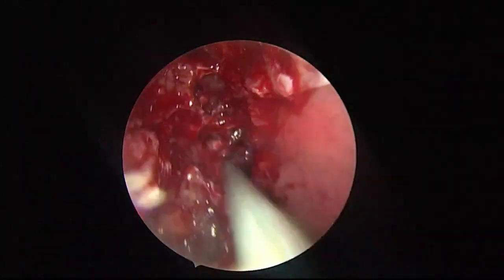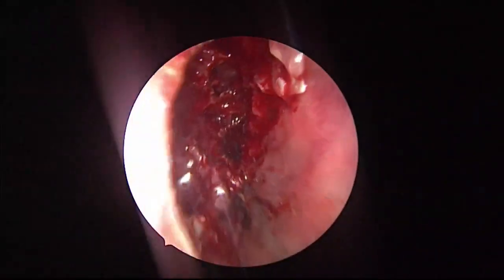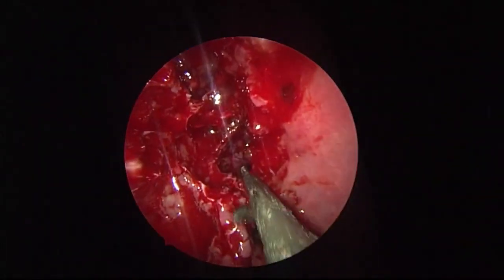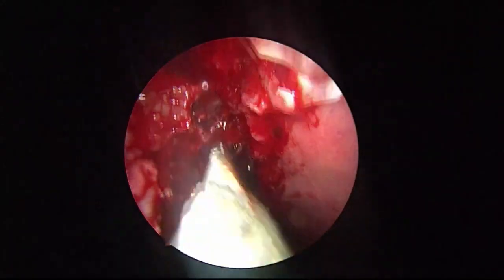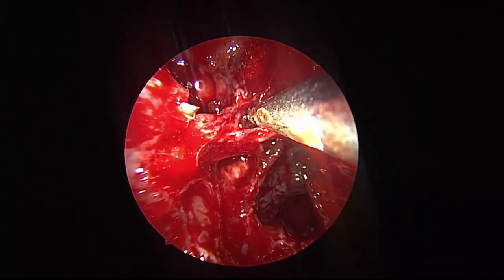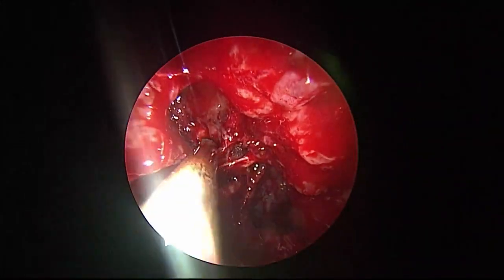All sinuses, good. That's the panoramic view. All clear, everybody?